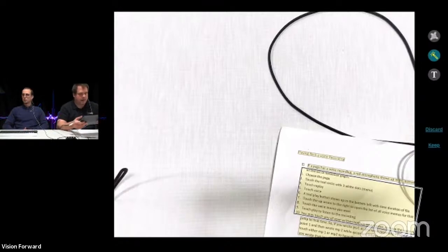And then we should have some options as well to import this and keep this in our library if we want. We don't have to. We can just discard if we took this picture and it was just something we wanted to quickly read. Otherwise, like I said, we can then bring it into our VoiceStream library and then have access to that OCR document at any point.